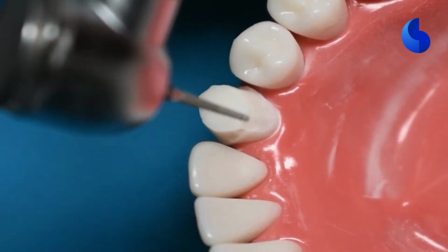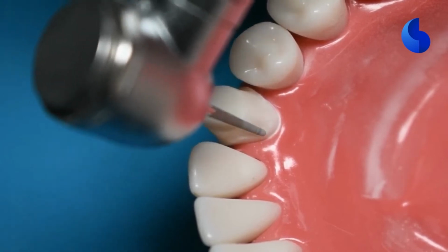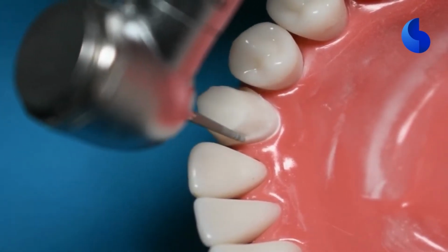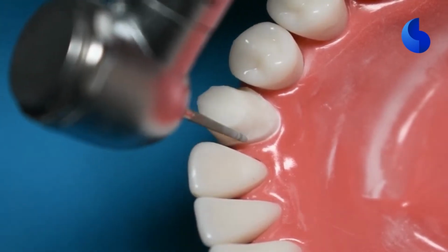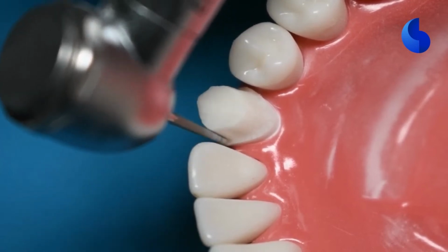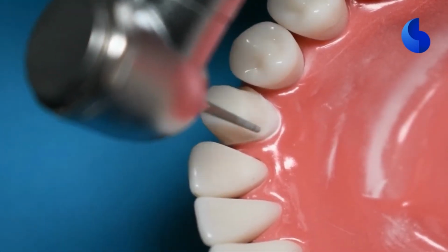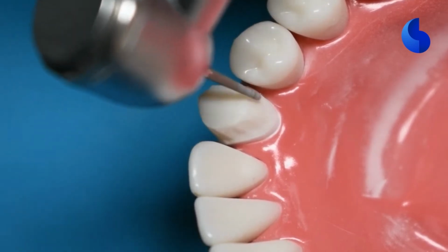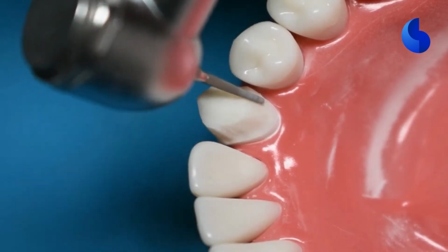All the time placing your burr parallel to the long axis of the tooth so that you're not creating too much of a taper, and keep your margin 0.5 millimeters supragingivally. As you can see, the initial reduction that we gave on this tooth structure on the lingual is helping us now, because now it's oriented perpendicular to the tooth that is opposing it.